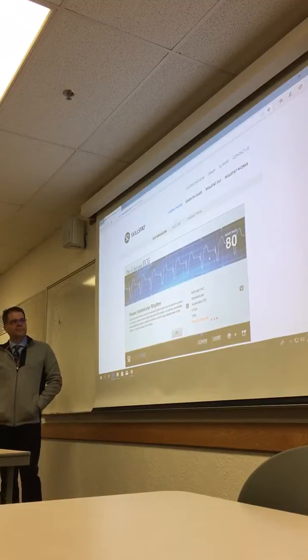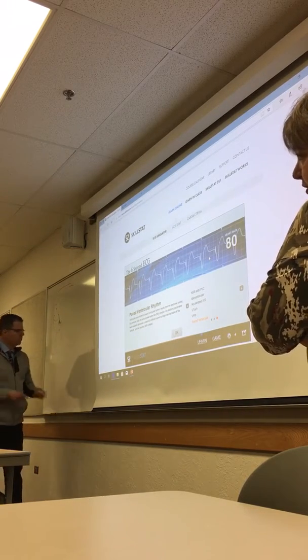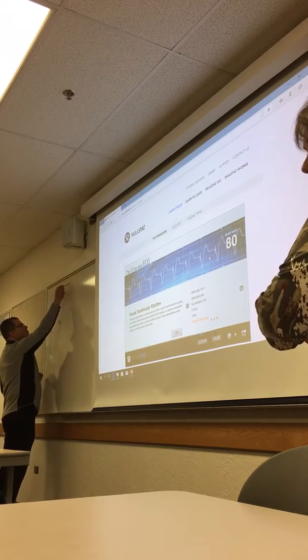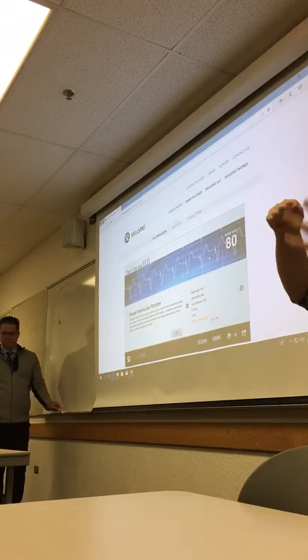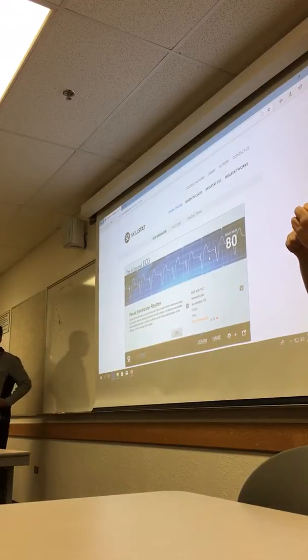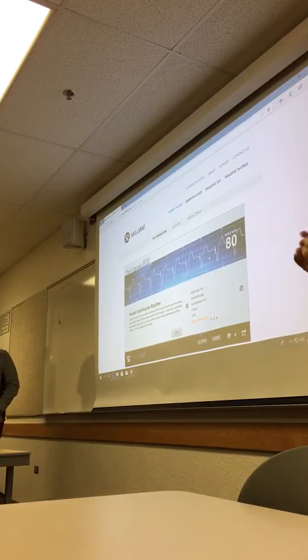It's very different. Now this is a very sick heart. It wasn't doing anything on its own, and so we are pacing just the ventricles. So you'll see there's no P wave, there's no coordination between the contraction of the atrium and the contraction of the ventricles. We are just giving a shock, and a ventricular cell is contracting. It's a big, wide QRS, so we know it's ventricular. And that's where the impulse is.